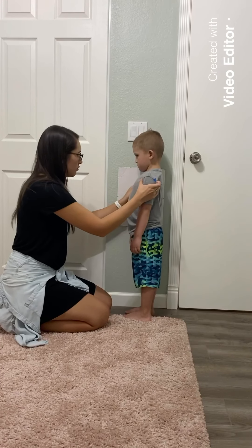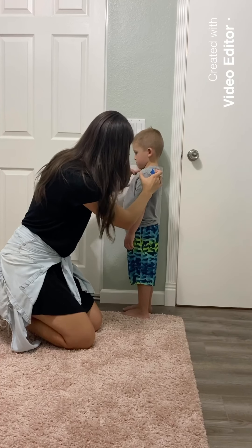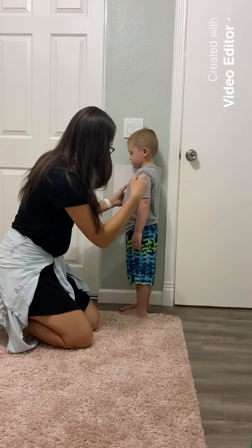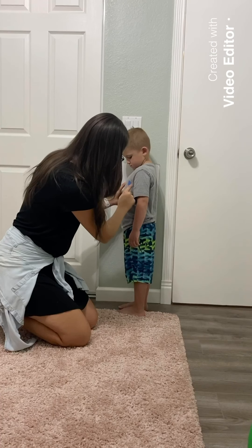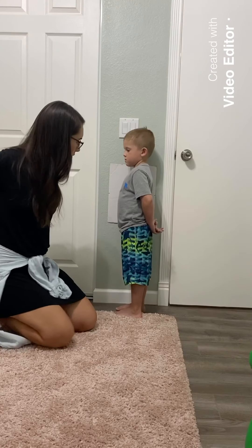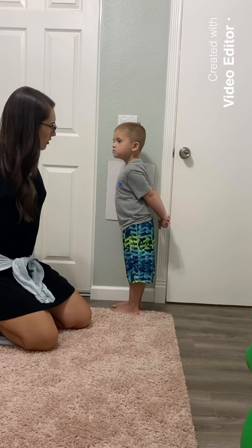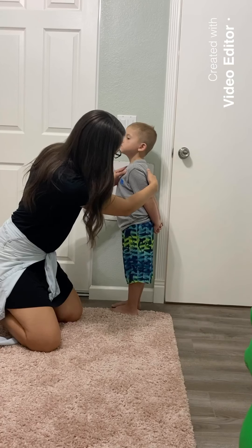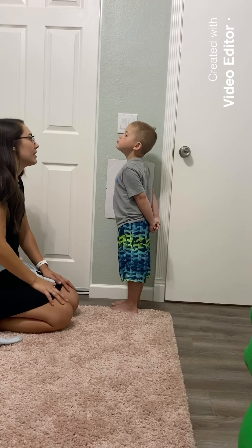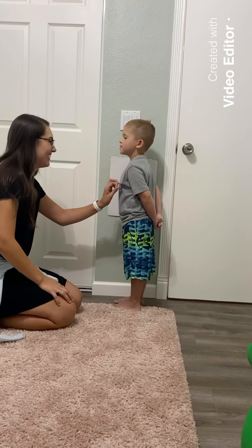Okay. Now go back. Perfect. And I'm going to center at his mid-sternum. I'm going to feel your ribs. I'm going to center right here and center at the IR. Okay. Put your arms behind your back like this — can you grab them? And pull them back. And stick your chest out. Hold super still right there, okay? Ready? Take a big breath in and hold it. Now hold it. All the way in. Hold it. Okay. You can breathe. That's it.